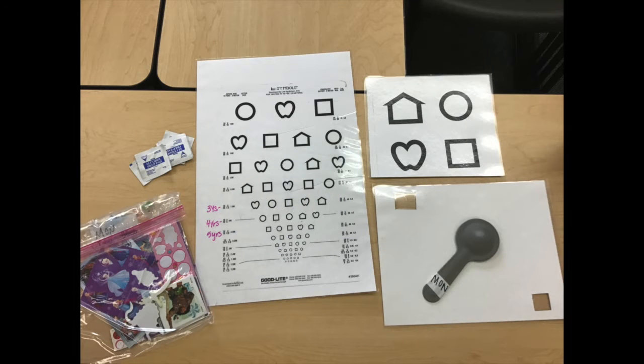Let's start with materials needed and setup. Here you can see there's a wall chart, response card, and occlusion tools. You need to decide whether or not you will be having the child sitting or standing because the wall chart needs to be secured at eye level 10 feet from where the child will be.